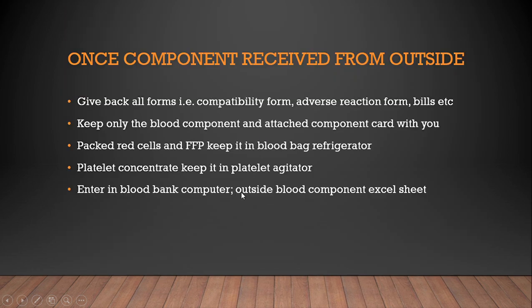Now if it is an outside blood you are receiving, once it is available, all the compatibility forms, adverse reaction forms, even the payment details and bills are brought to the lab. You give back all these bills. You keep only the blood component and the component card, which has the patient name and all those details. Only these things you keep with you. All other details you give back to the respective ward.